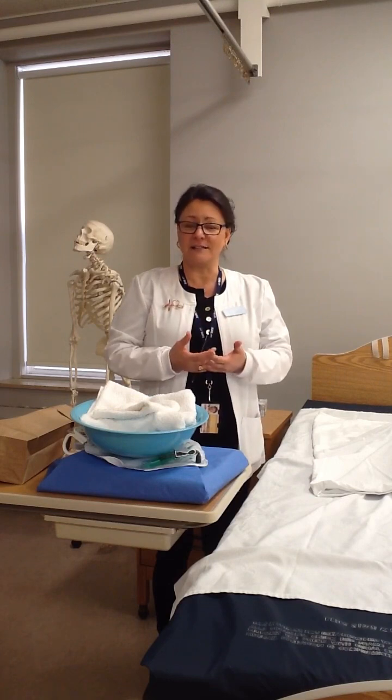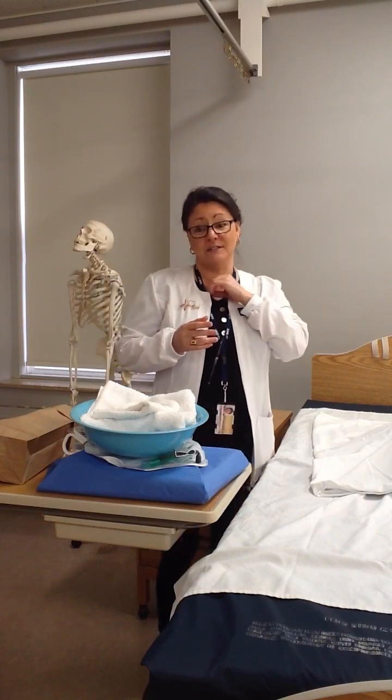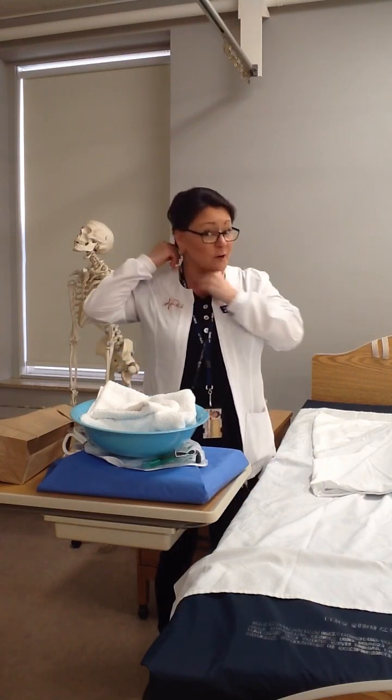Today I'm going to show you a demonstration of catheterization of a male using the principles of sterile technique. Sterile technique and aseptic practices maintain an area that is free from pathogenic organisms. It separates a sterile field environment from an unsterile environment, and it minimizes the patient's exposure to infection-causing agents, thereby reducing the patient's risk. Anything we can do to promote health and prevent infection for our patient is a strategy that nurses hold dear. So sterile technique is one of those ways.